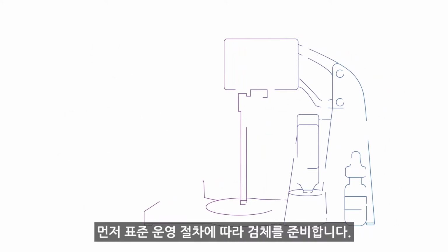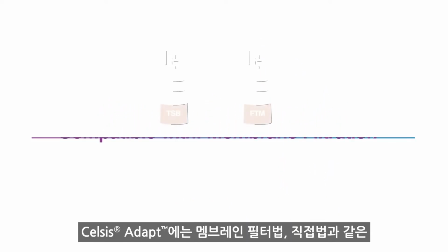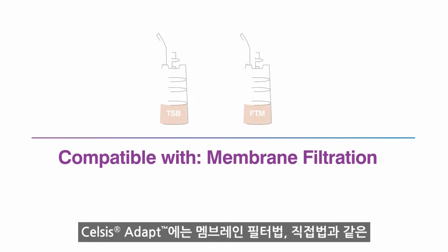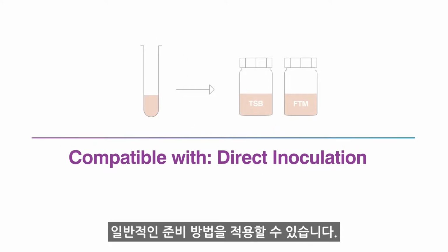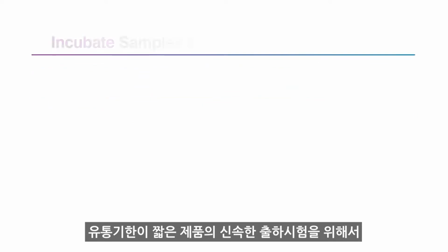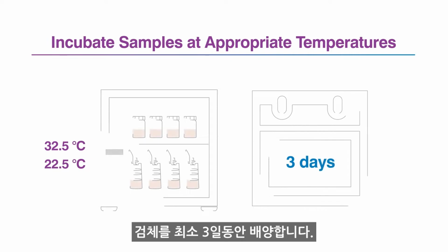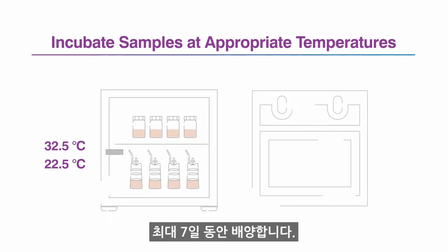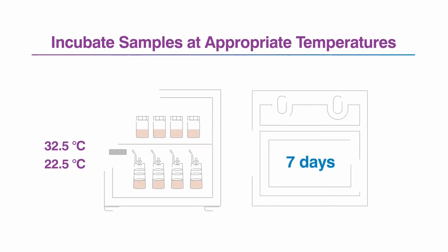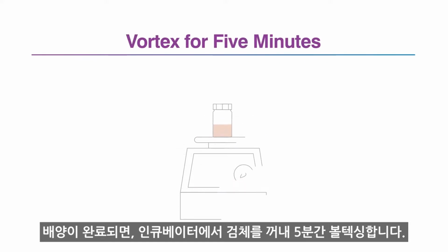Start by preparing your samples according to your standard operating procedures. The Celsis Adapt assay is compatible with compendial preparation methods such as membrane filtration or direct inoculation. For rapid release testing of short shelf-life products, incubate samples for as little as 3 days. For cell culture or cell-containing in-process samples, incubate samples for up to 7 days. Once incubation is complete, remove your samples from the incubator and vortex for 5 minutes.